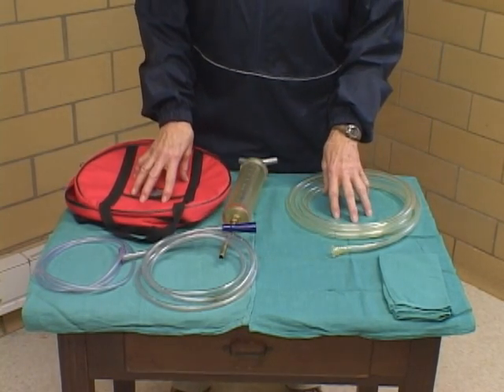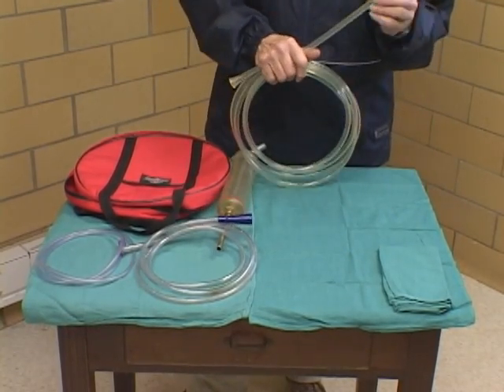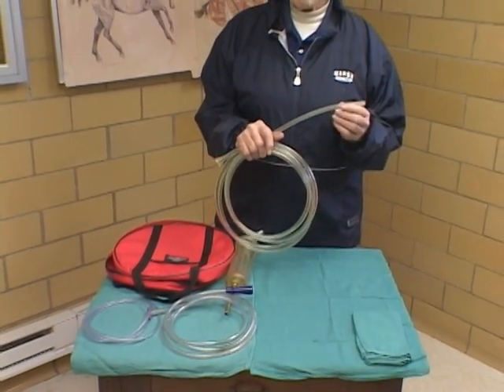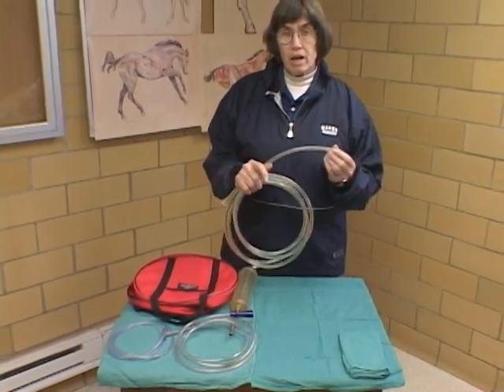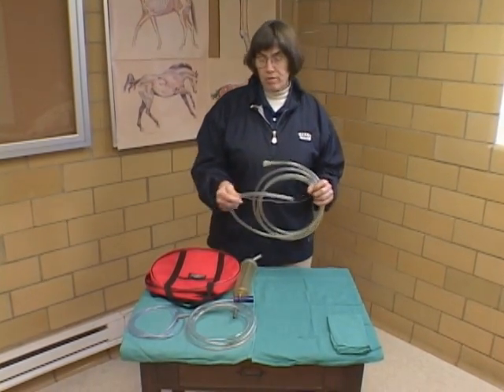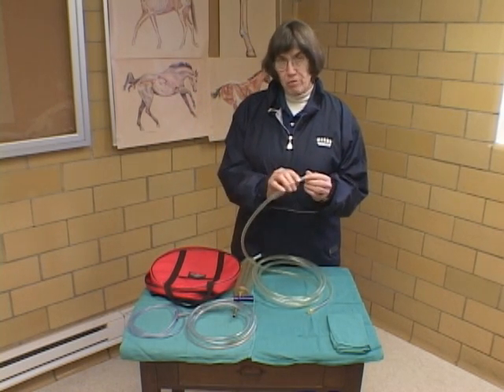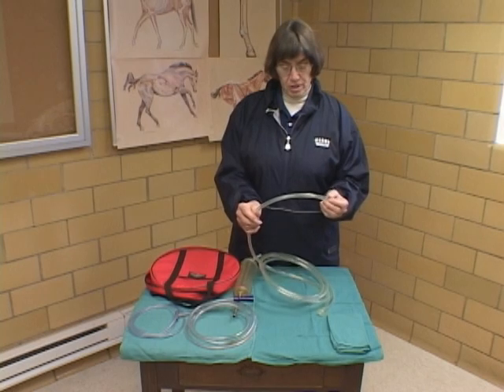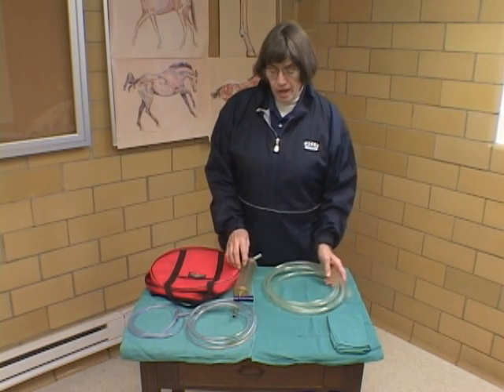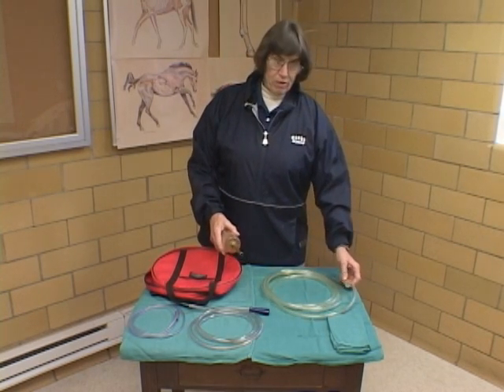We get very possessive of our tubes. We like them for a certain type of consistency that they have. We like the tubes to be kept very clean, we don't want them to be damaged or dropped on the ground. We don't want them to be rough because that's going to cause irritation to the nasal mucosa, so we like them to be nice and smooth. They have to be taken care of when they're out of the horse.